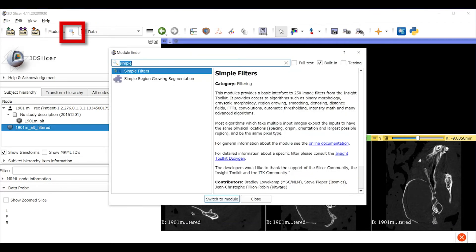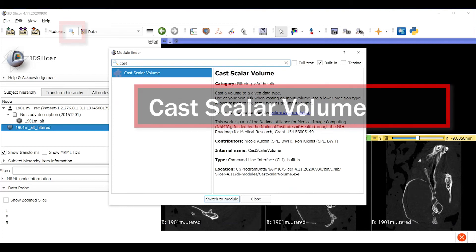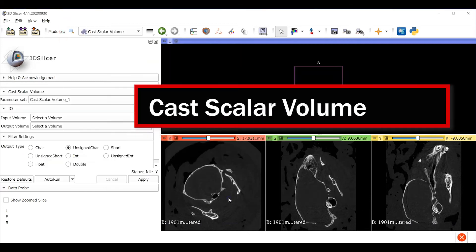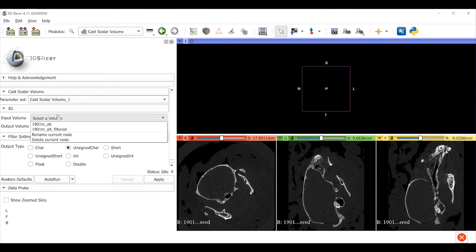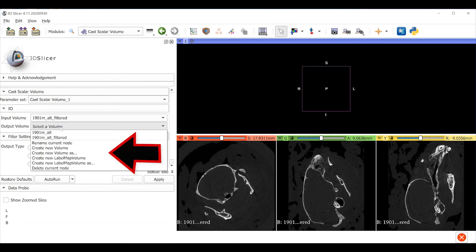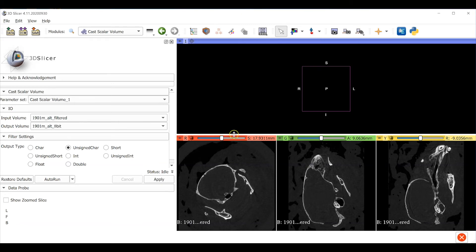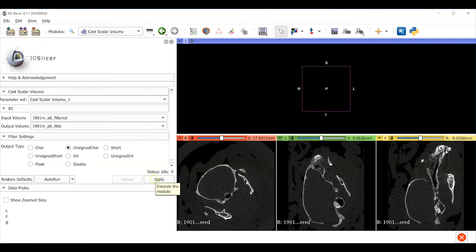We go back to the data module and you can see that this new object has been created. Now use the magnifying glass icon again to search for the cast scalar volume module. Choose the filtered 0 to 255 grayscale object we just made as our input and create a new output volume. Here I appended 8-bit to the name of the new output object. Under output type, select unsigned character. This is an 8-bit data type. Then click apply.